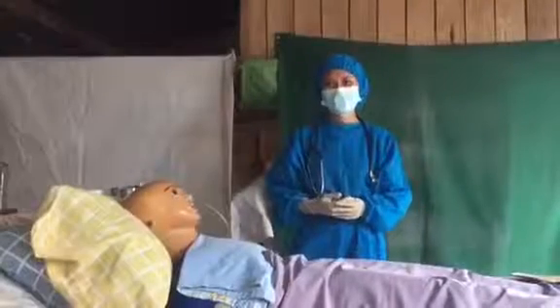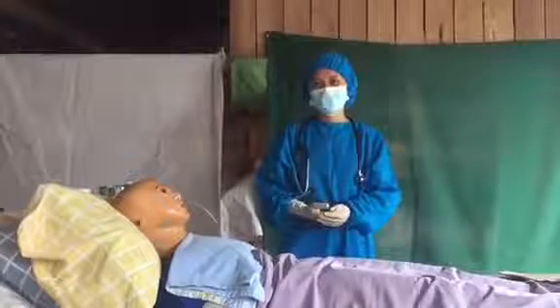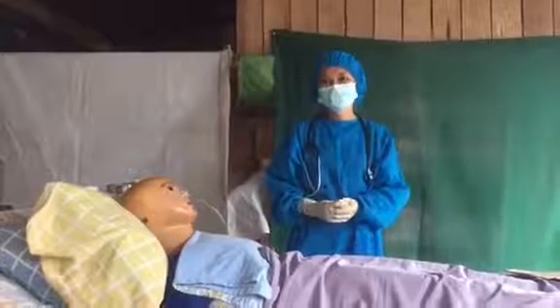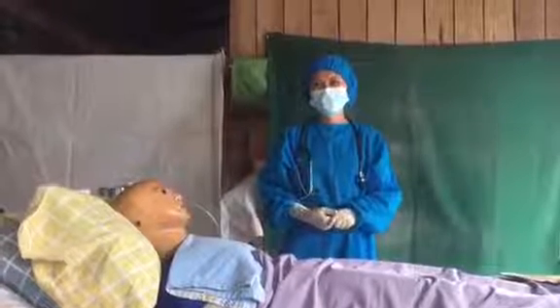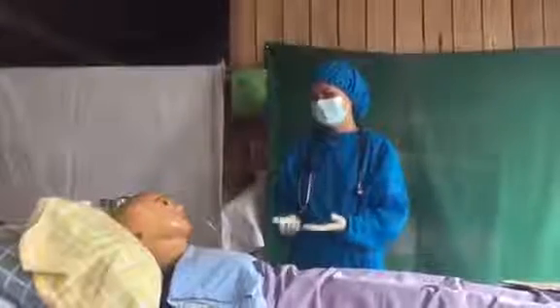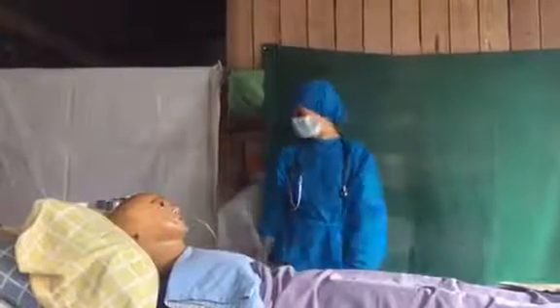Okay, so let's get into gavage or the feeding. So before anything else, we should know the patient's data first, such as name, birthday, sex, civil status, address, and most important is their vital signs. And then next is to read the doctor's order about the patient's condition and the doctor's diagnosis to the patient. Good day, ma'am. I am Shalamit Dio, your caregiver, and I'm going to perform the gavage as the doctor's order.